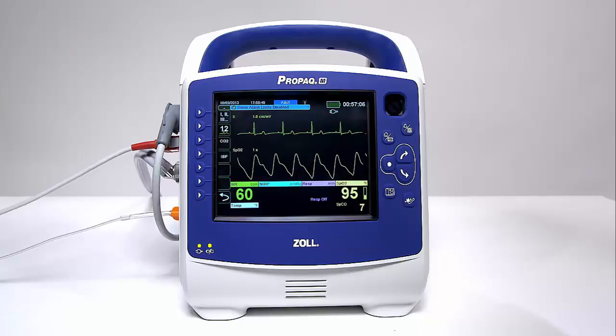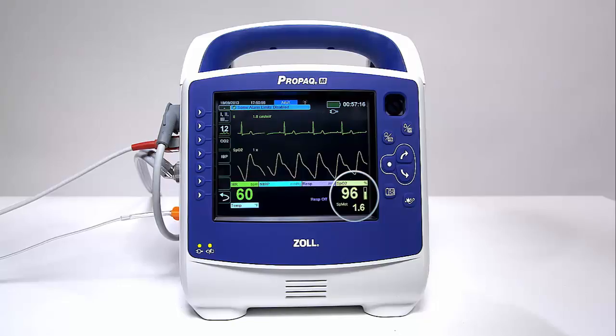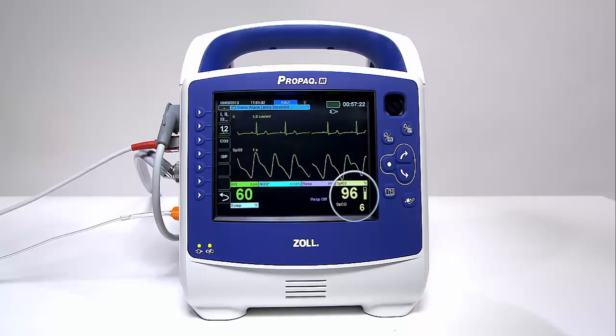It will automatically display the SpO2 value and the pulse bar in large numeric format, with additional co-oximetry options automatically scrolling in the lower portion of the SpO2 window. The SPCO and SPMET measurements will automatically appear and alternate underneath the SpO2 display.